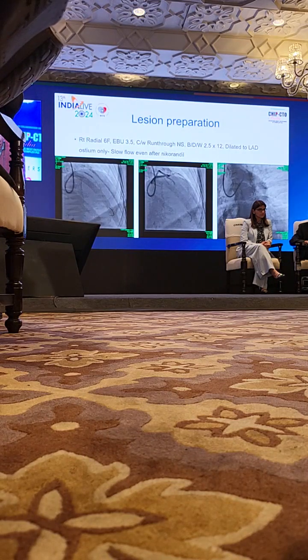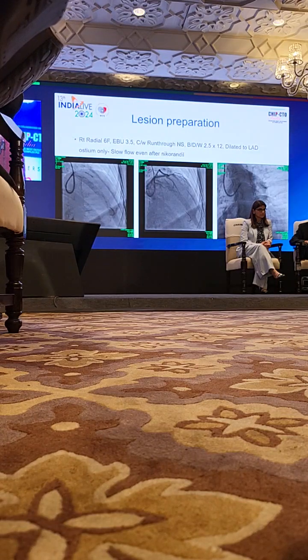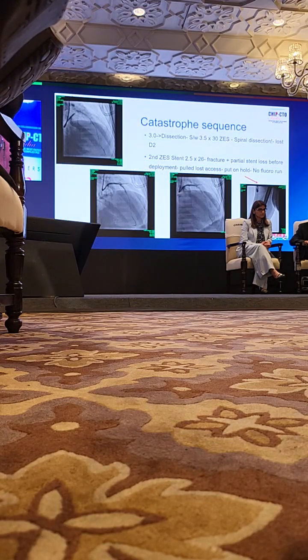We looked at these shots and we thought, okay, I don't think we can nail anything here. We'll have to come back to the left main. So we went ahead and aggressively pre-dilated the distal left main LAD ostium complex with the 3 balloon. There's some dissection there that we can see. Now to try and conserve finances, we thought, mistakenly in retrospect, that we can get away with one stent.